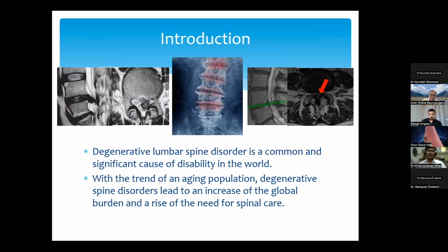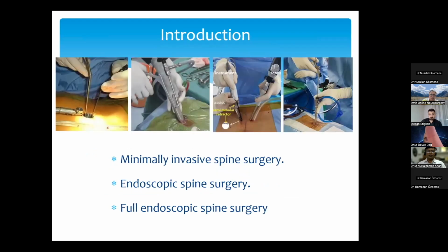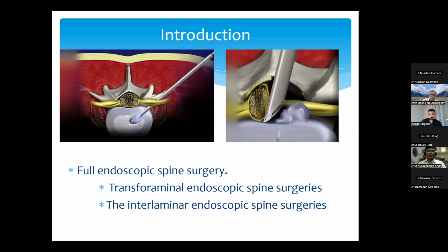The concepts of functional preservation and enhancing postoperative recovery, minimally invasive spine endoscopic surgery, in this full endoscopic spine surgery is used on a variety of spine pathology. The interlaminar and transforaminal endoscopic spine surgery have been the representatives for the full endoscopic spine surgery. Each technique has developed many modalities and skills in treating different pathologies.